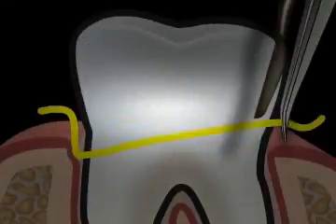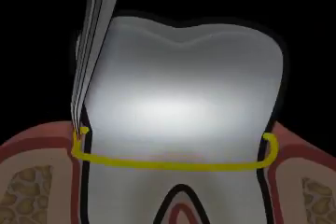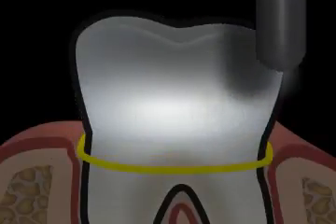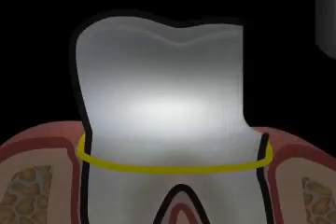There are several reasons why we use ligatures. Firstly, because you don't want to grind the gums away, and secondly, because the abrasion limit should be reached in the so-called sulcus, that is to say, below the visible border with the gums. With the first ligature, therefore, we pull the gums to one side in order to avoid injury whilst abrading, and the limits of the abrasion can therefore reach down into the sulcus. Fair enough, but why are there 2 ligatures? This portion of the video will help explain.